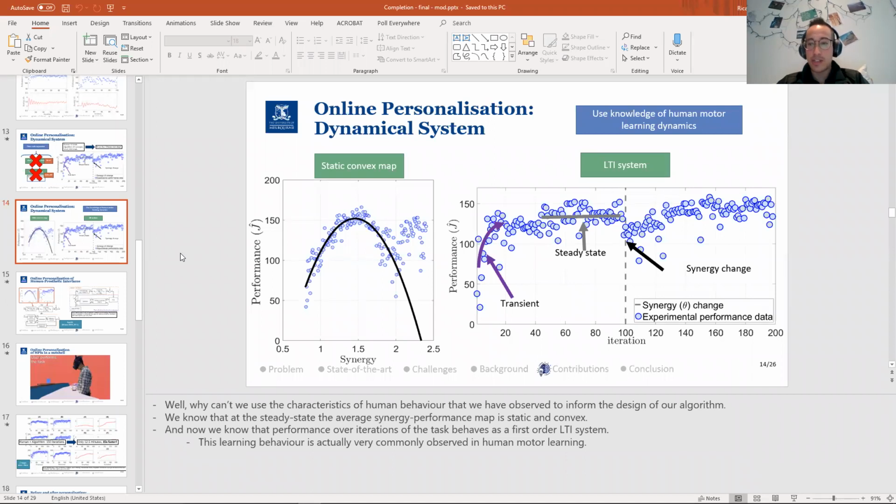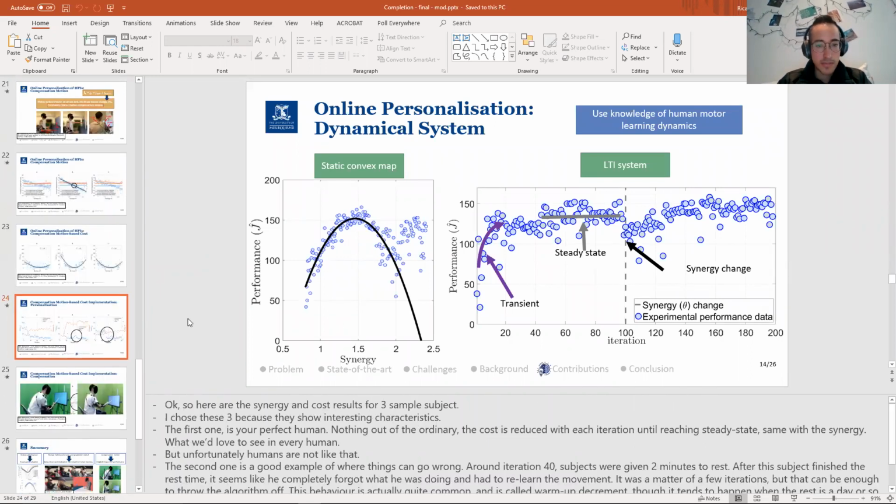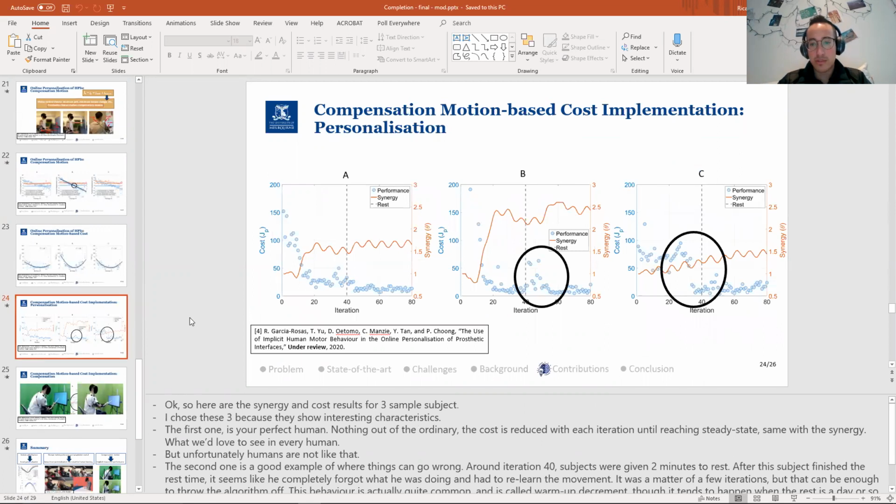It was actually running at the same time. So in every iteration there will be an update, and I didn't have the parameters, but I don't know if we can see it in one of the plots. But the change was relatively small in each one of those iterations. If the dither was too large, or the update was too fast, it would cause problems for people trying to do this. So it still needs to be relatively slow in the update.